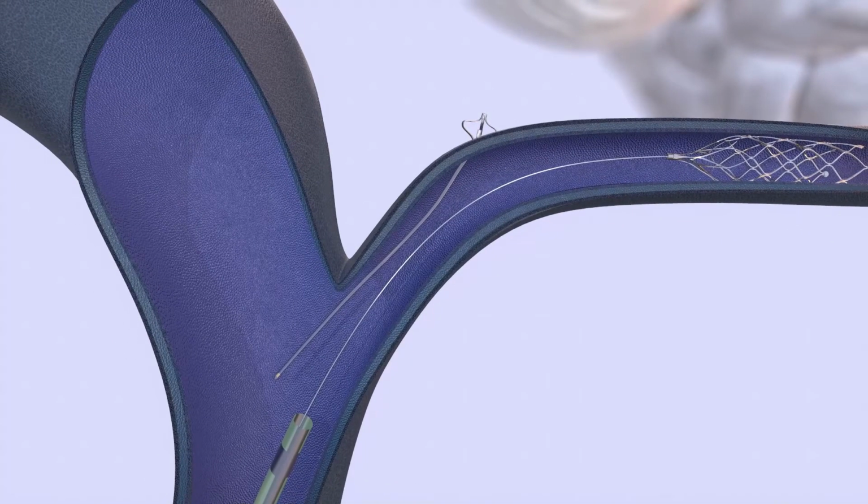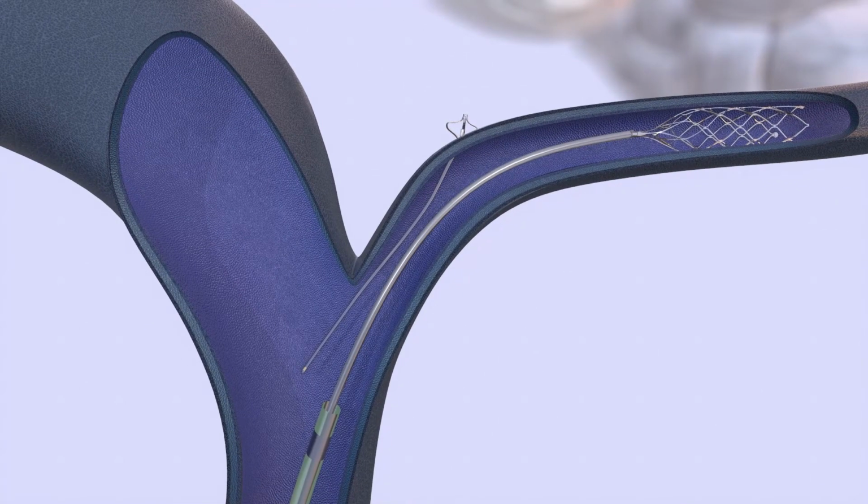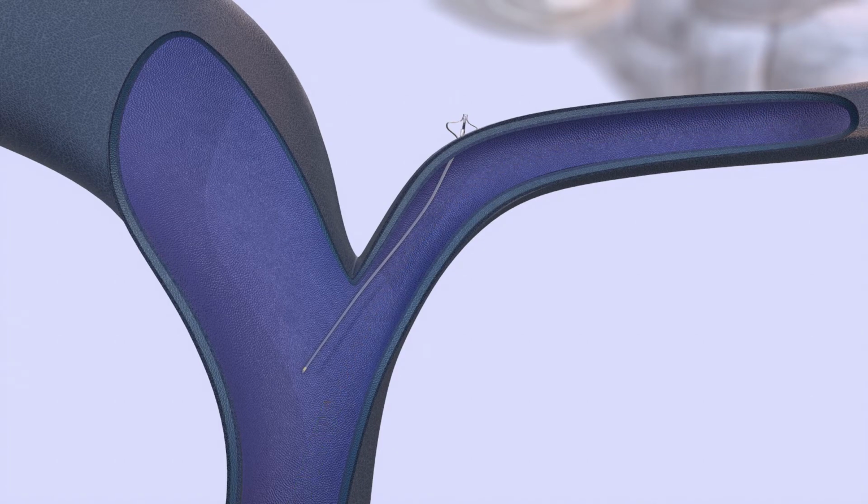Once the implant is in place, the microcatheter is reinserted over the flat rail and advanced into the IPS beyond the deployed implant. The e-shunt anchor is recaptured and removed from the patient to complete the procedure.